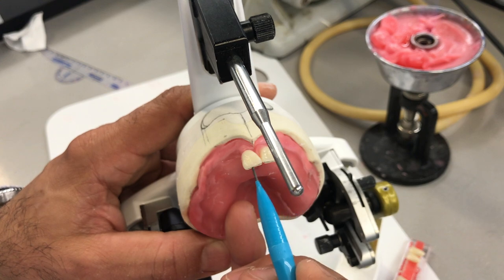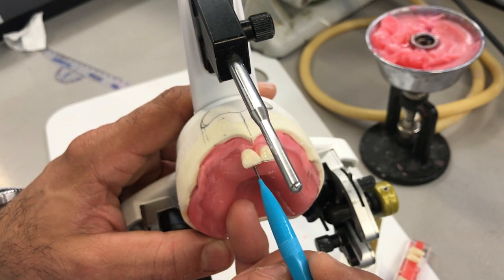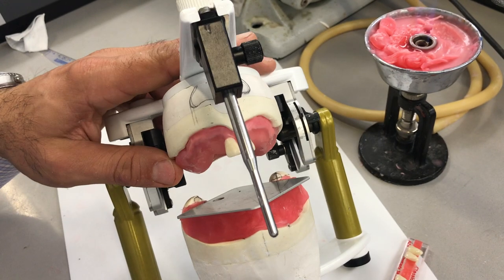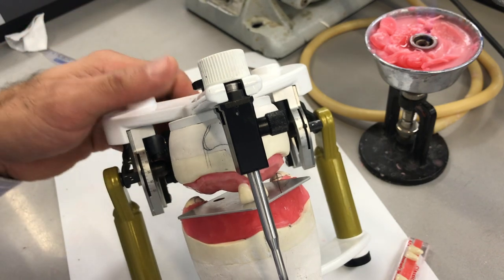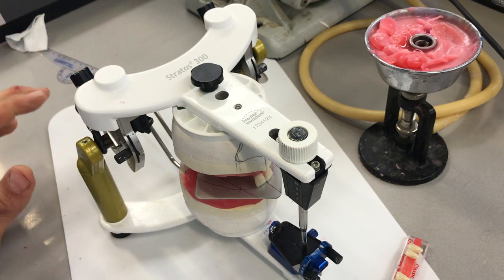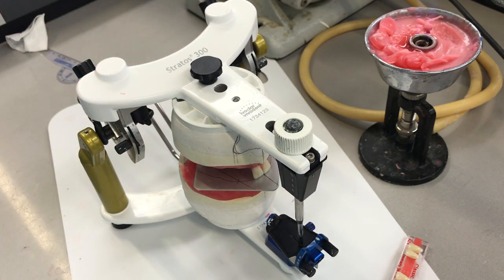This labial curvature will start taking shape. Whatever we're doing, the left side is going to mirror the right side and vice versa, so this is an important starting point to make sure we get on the right track. If we look at it from this view, the incisal edges are right over my pencil line.